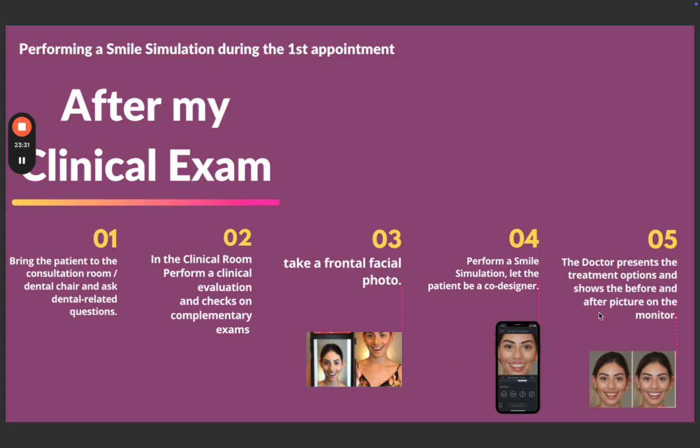And in the fifth step, the dentist will present the treatment options, and shows the before and after picture either on the iPad or on the monitor. It's important to understand that the smile simulation cannot be shown on an iPhone since the screen is very small. Therefore, we encourage you to use either the iPad or bigger monitor.